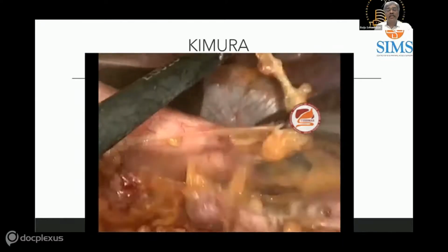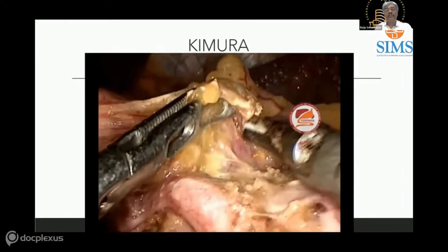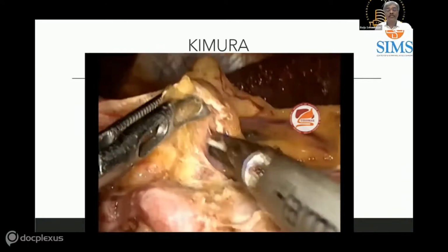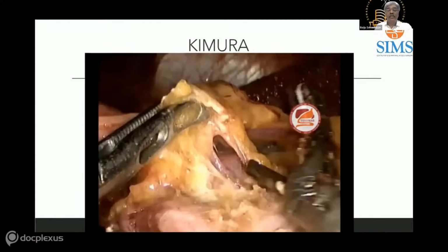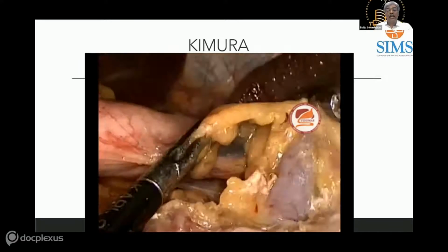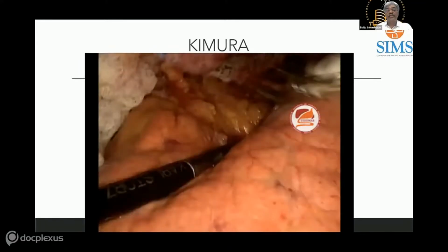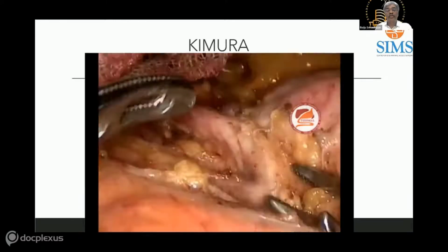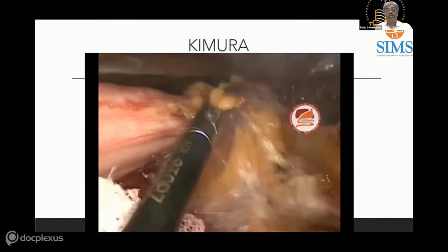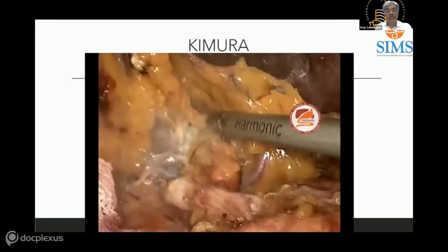It's better to take biopsies for sampling of the lymph node, and the artery and veins are exposed throughout. Now the attachments from the artery to the parenchyma are taken care of with the harmonic scalpel or with the clips.